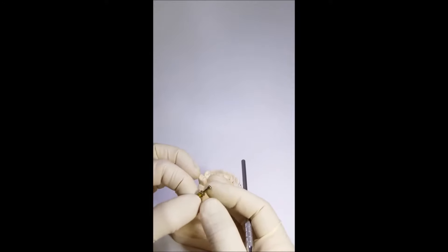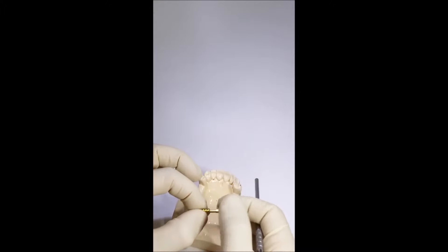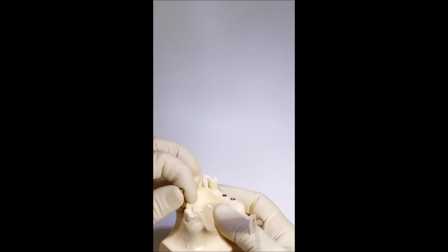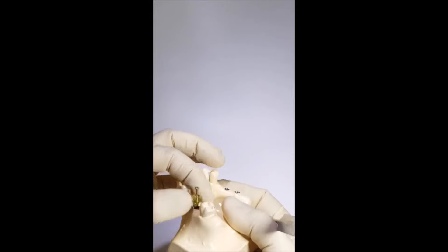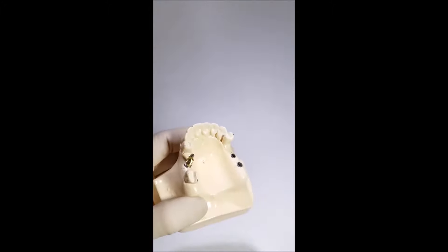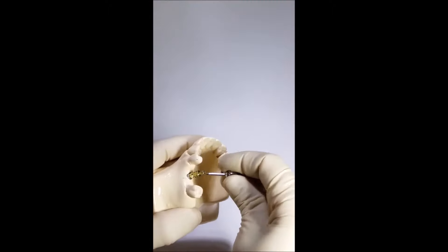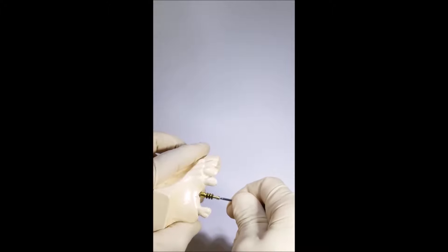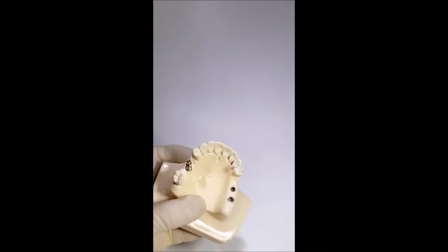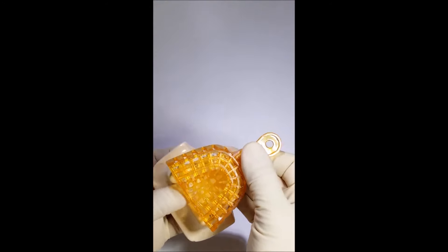To implement the open tray impression technique, we use a special transfer which has a body with special retention points and a long screw which goes through a hole in the tray. This transfer is installed in the implant in the oral cavity of the patient, fastened with fingers, and later screwed with a screwdriver from abutments. Then the necessary size of the tray is attached to the shape of the jaw, inserted into the oral cavity, and the area where the transfer screw should appear is marked.